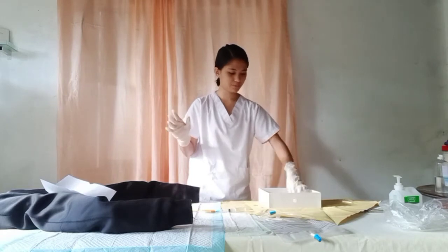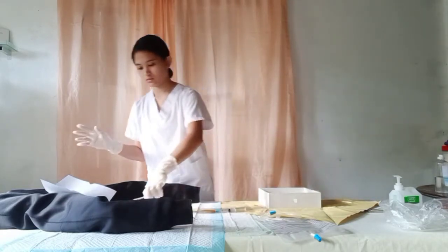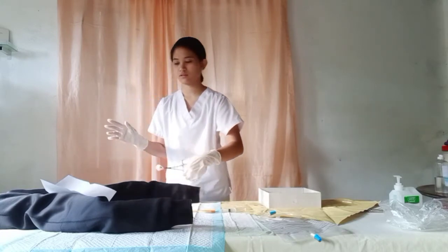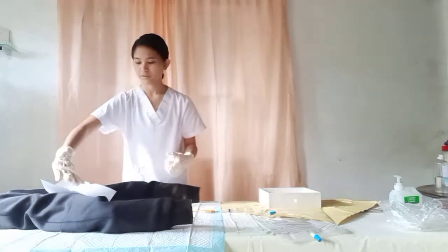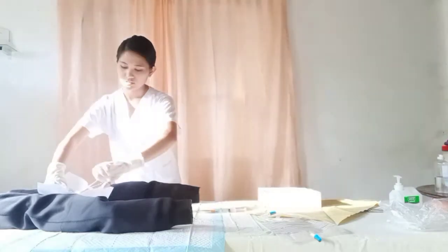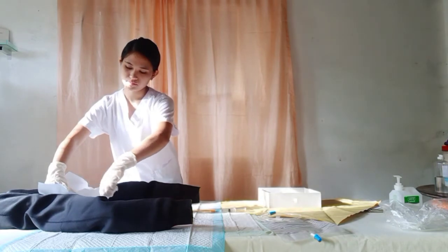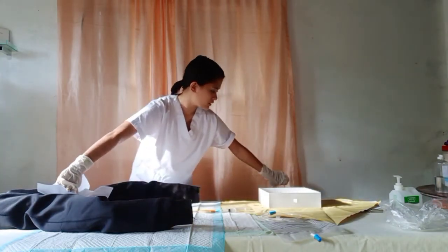Using your forceps, pick the cotton balls with the betadine, and using your non-dominant hand, hold the upper meatus and then clean the left side first. Then maintain the sterility of the field.